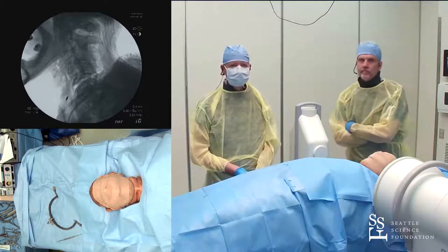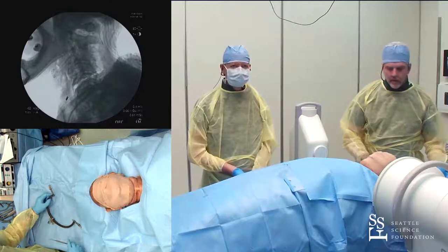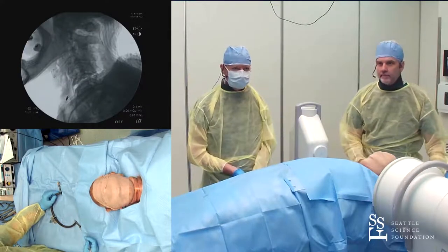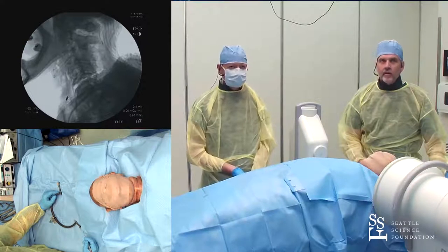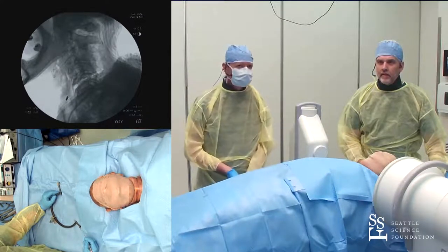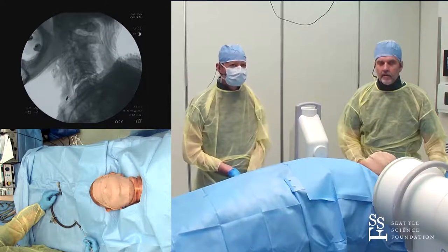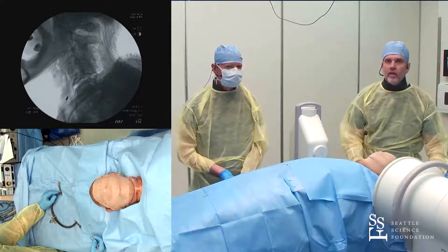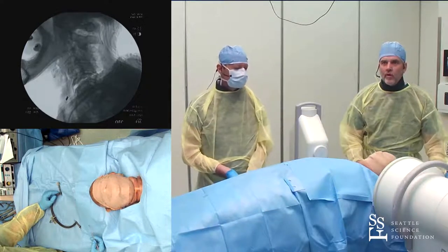Why don't you guys start your procedure and walk us through it — are there any tricks in terms of how you apply the tongs, where you apply them, how you set the patient up, bed position? Walk us through your technique, because I think there are a lot of subtleties to doing this that often get missed when you just say 'put on tongs and pull.'